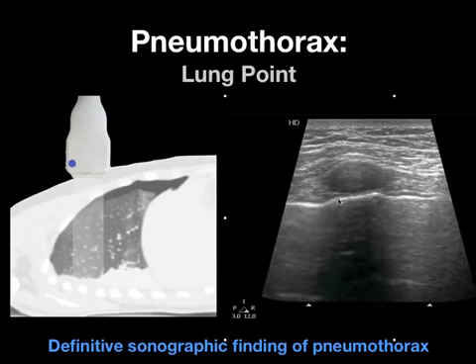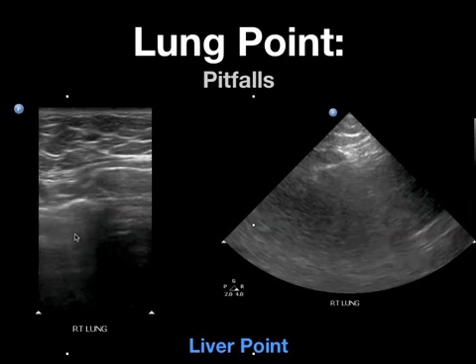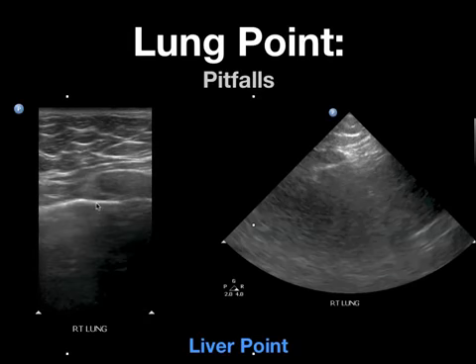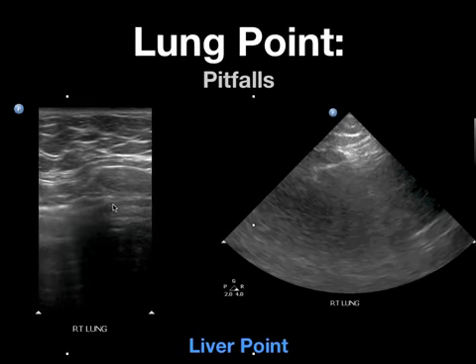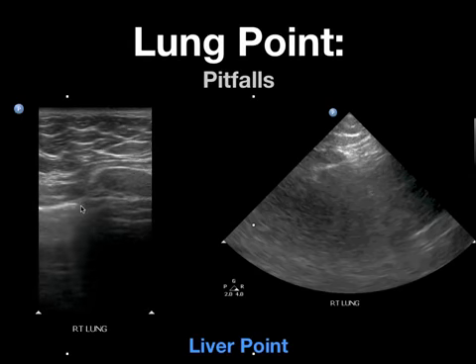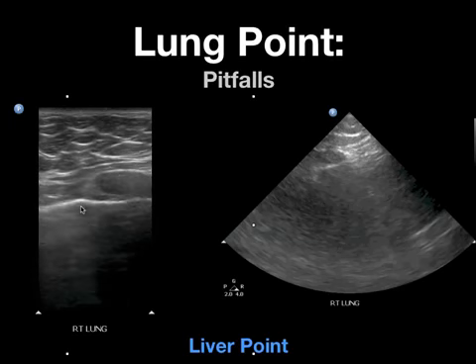You've got no pneumothorax here, pneumothorax here, and this is how it matches up against this CT scan. Just be careful when you're scanning by the border of the lung. This looks like a lung point here, where you've got lung sliding that stops right at about this point, but you can see that there is something moving right here, but it has a different echogenicity than this point right here. And it's difficult to see with a linear transducer because of the focused area of visualization.